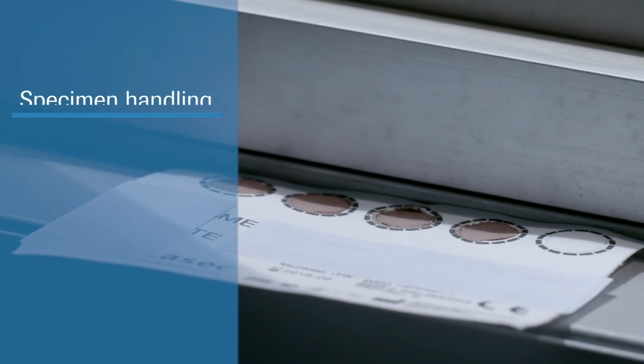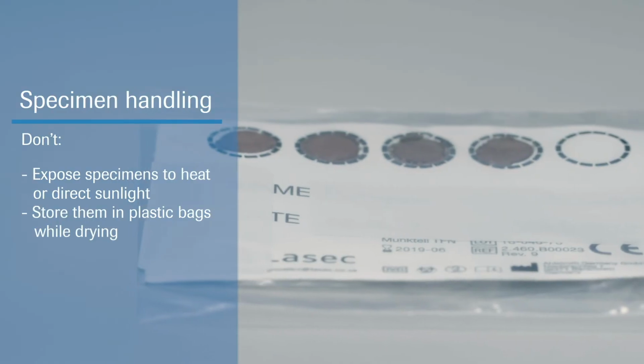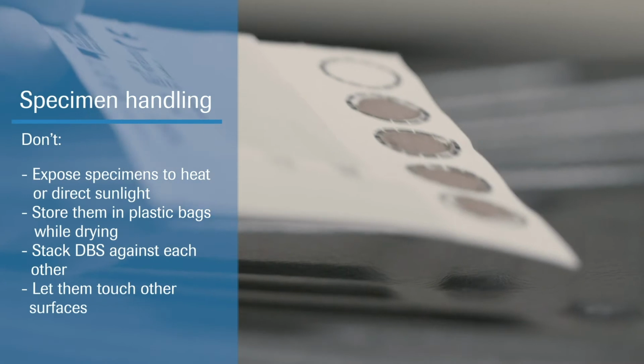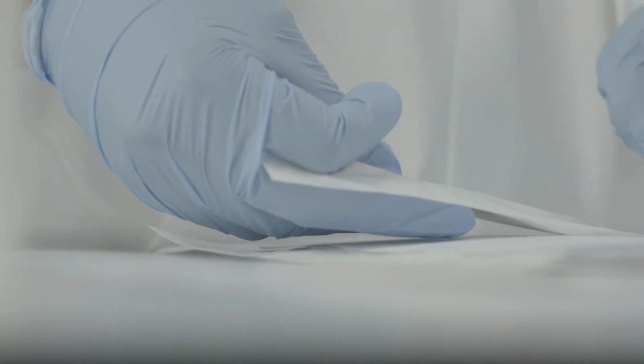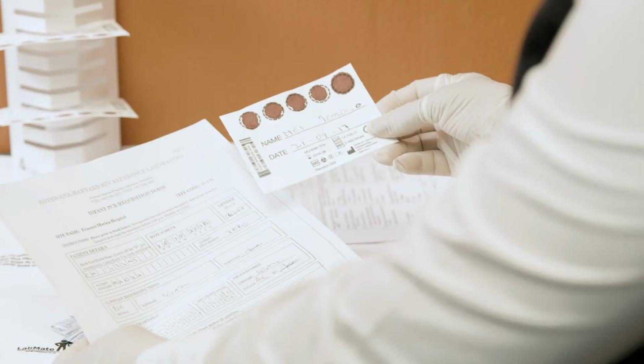When drying specimens, don't expose them to heat or direct sunlight. Don't store them in plastic bags. Don't stack them against each other. Don't let them touch other surfaces where water or debris can contaminate or render the specimen invalid. If a card has not been dried correctly and completely, it may not be able to be tested.